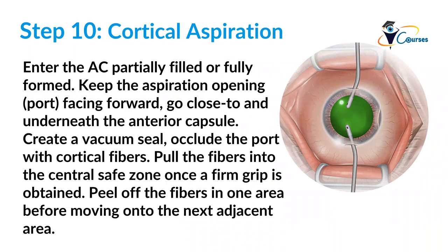You think that the problem is in the vacuum, so you increase the vacuum. And what will you find? That the nucleus is eaten by the vacuum, not by the ultrasound. You didn't even reach that level. So the key here is to have low vacuum, not high vacuum.